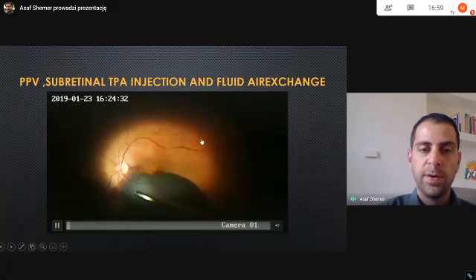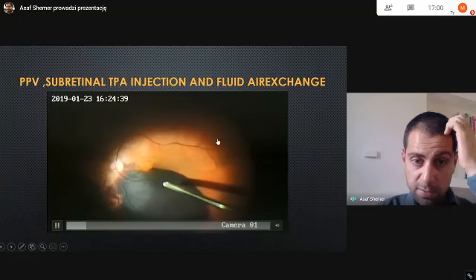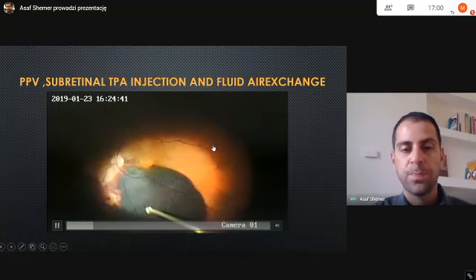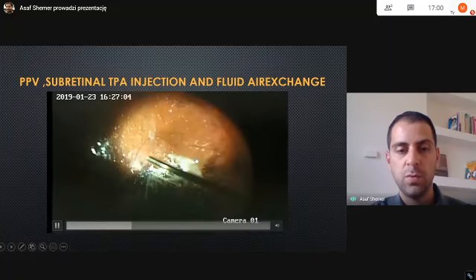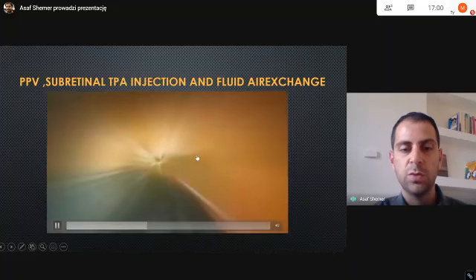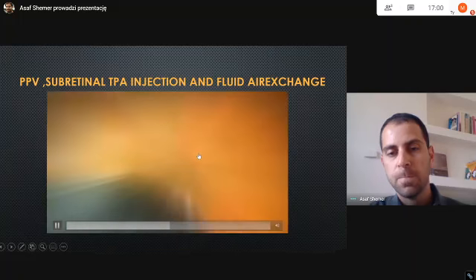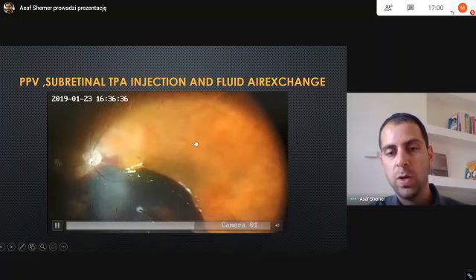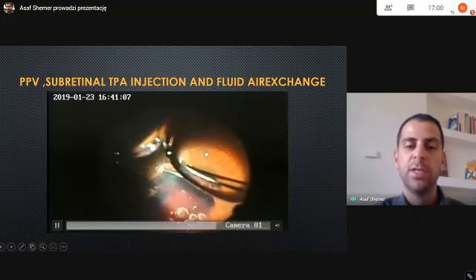So prior to a pars plana vitrectomy, the patient undergoes a single anti-VEGF injection. Then a core vitrectomy was performed. We induced a PVD with triamcinolone, as seen in this video. Then a retinotomy was performed with diathermy, and tPA was injected. Finally, fluid-air exchange was done. Following the surgery, the patient was instructed to lay in the face-down position.